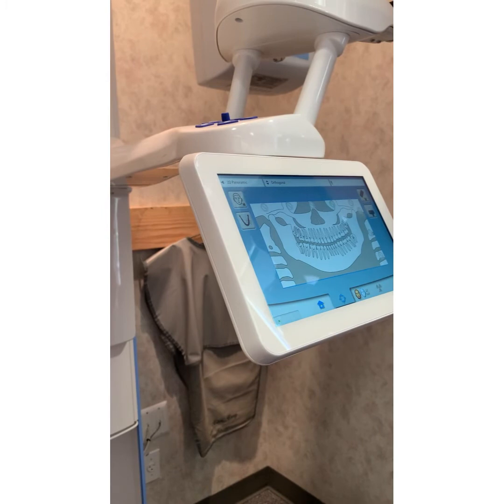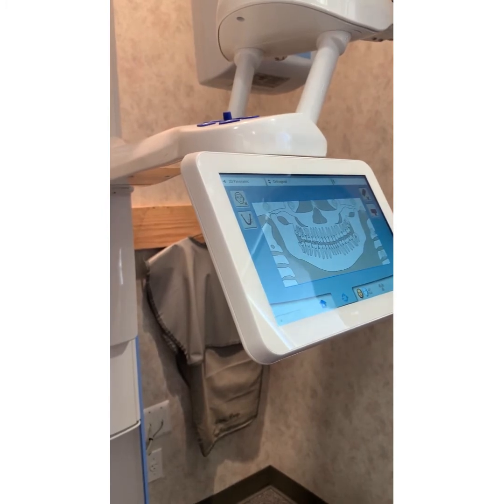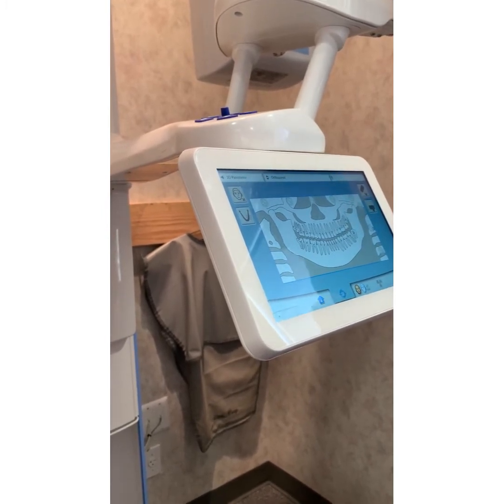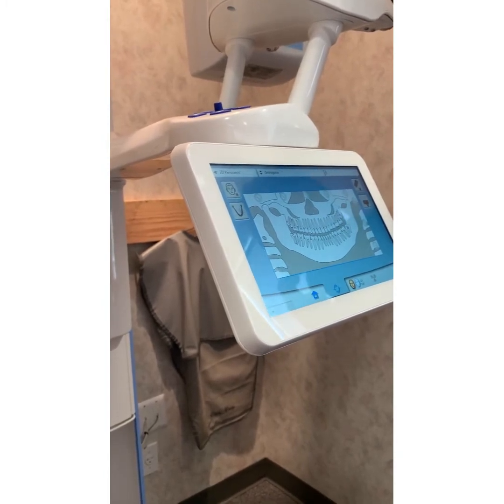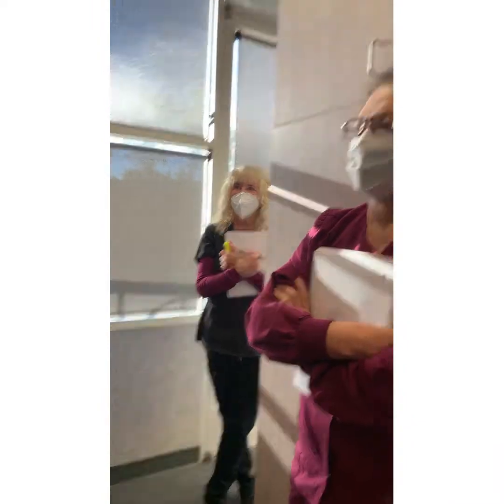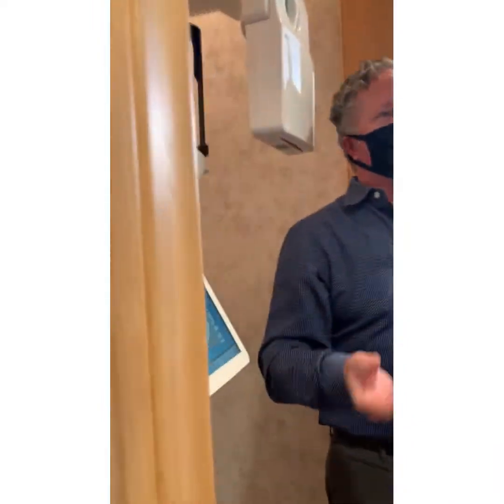I know. I've got 2 teenage boys. Some of their friends look like they fell down the stairs holding a fishing tackle box. They got all this crap in the face. Take it all out to minimize the amount of artifact you get. Yeah, their tongue, all that stuff. And when you have a barbell that they can't take out, then you can explain to doctor, well, you can't take that out. That's that artifact, and that's the way it goes.